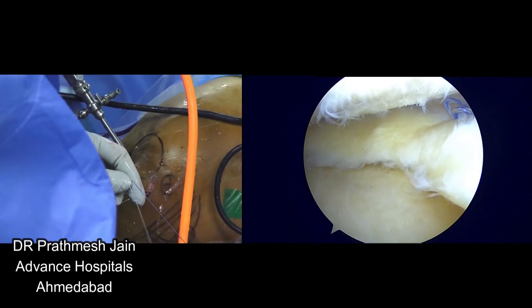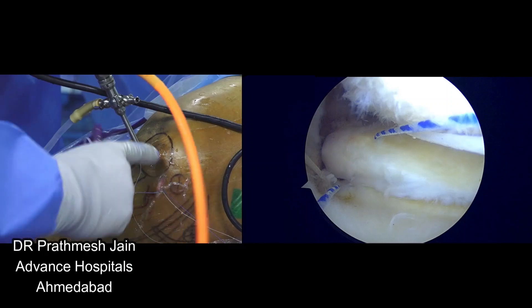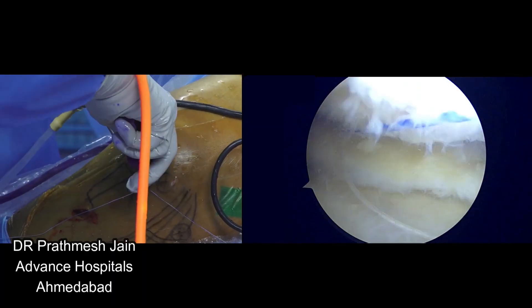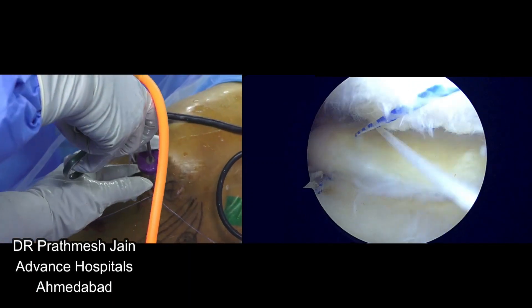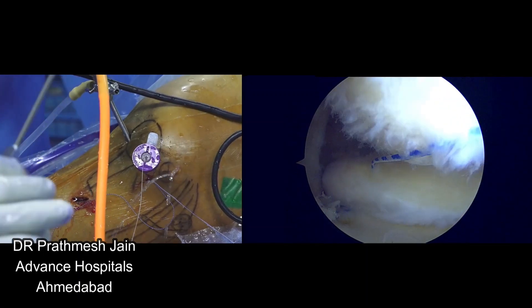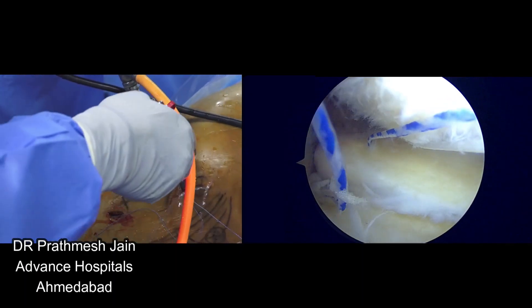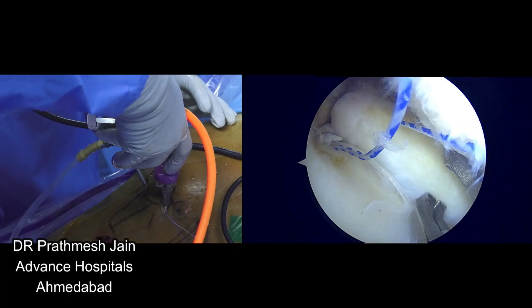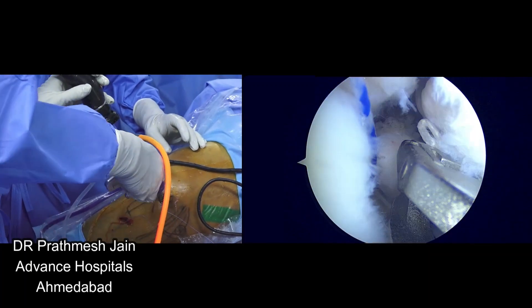We will probably pass a third suture limb which is again white. You can use artery forceps to hold those sutures which you have passed. We have passed two and I will now be passing my last suture through the meniscus root at this stage. I'll pass it underneath the meniscus, maybe in this region, probably like this — we are done.